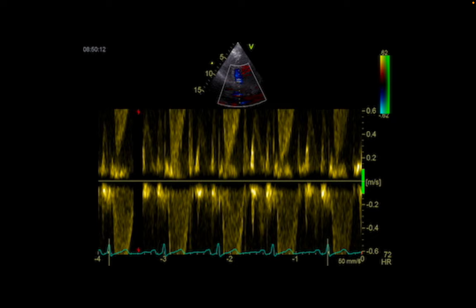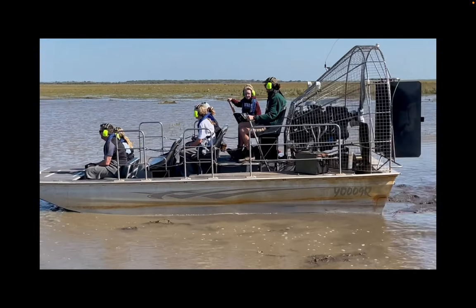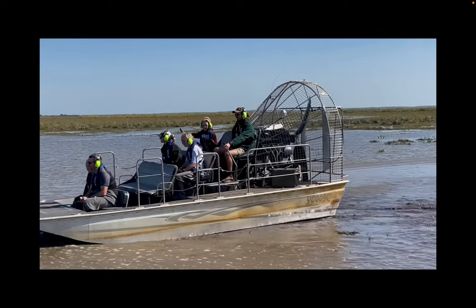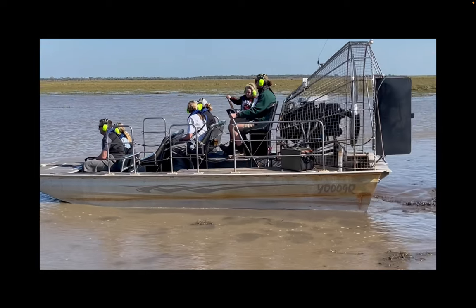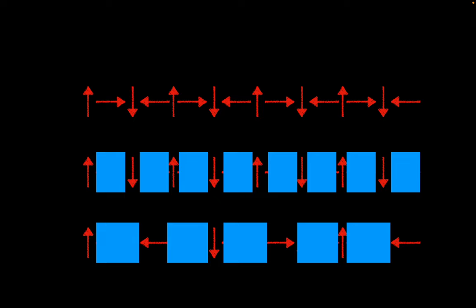When you start pulsed wave imaging, sometimes the ultrasound machine will give you strange-looking images. For example, there's flow away from the probe and at the same time what appears to be flow towards the probe — which obviously cannot happen simultaneously. This is an erroneous image from the ultrasound machine. This phenomenon can be understood using the analogy of a propeller — you just don't know which direction it's going. This is called aliasing.